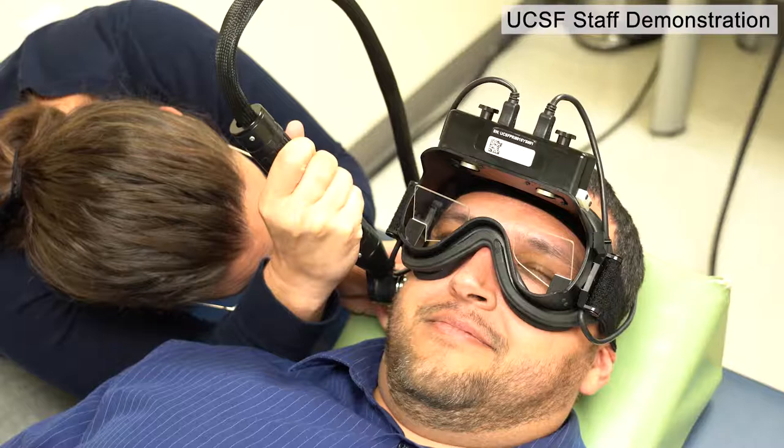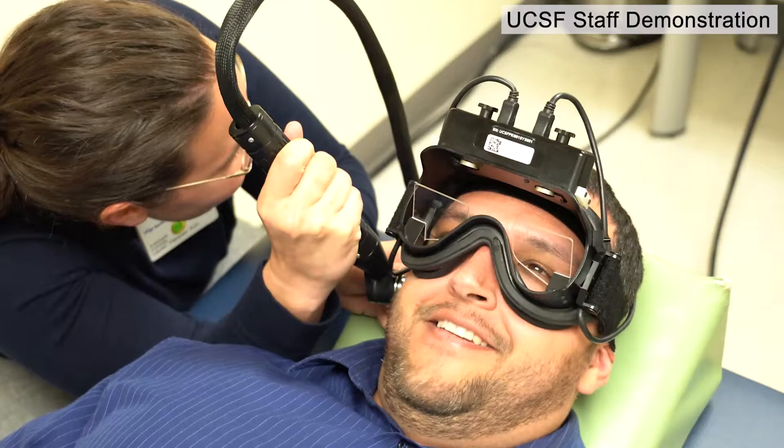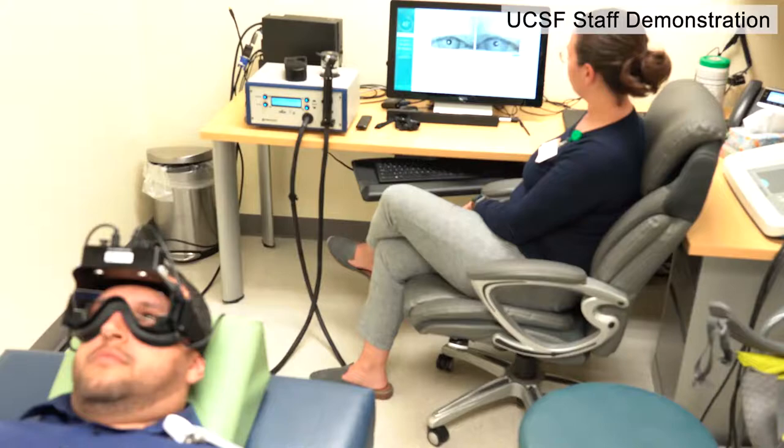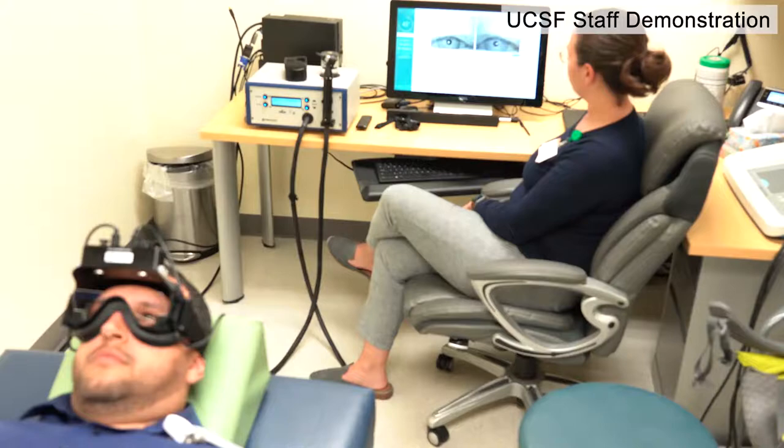It's important to know ahead of time that vestibular testing can be uncomfortable. There aren't any long-term effects, but it's not unusual to feel fatigued or slightly unsteady after the test, and depending on the cause of your symptoms, the test could cause motion sickness or nausea.